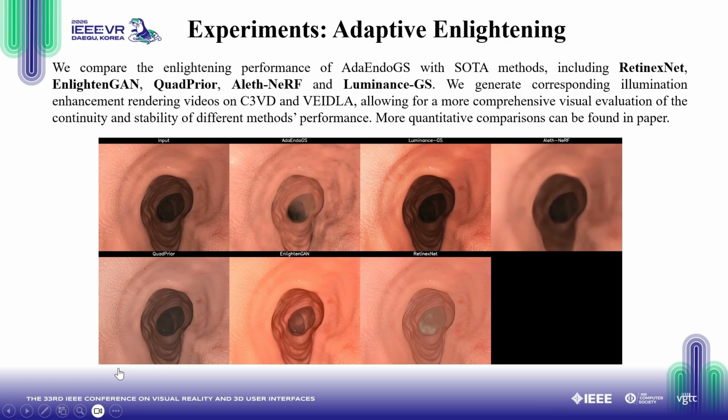The video shows our method's superior continuity and stability. We recover clear anatomical details in dark regions with no color distortion, artifacts, or overexposure in bright areas. Quantitative results are detailed in our paper.